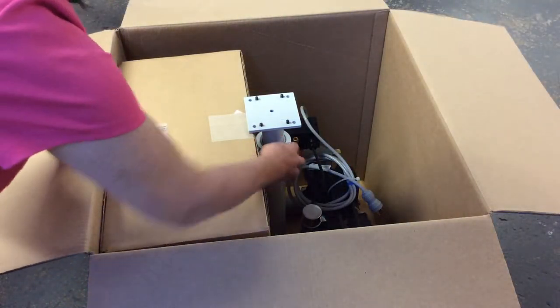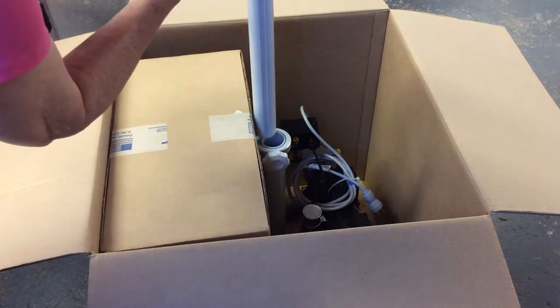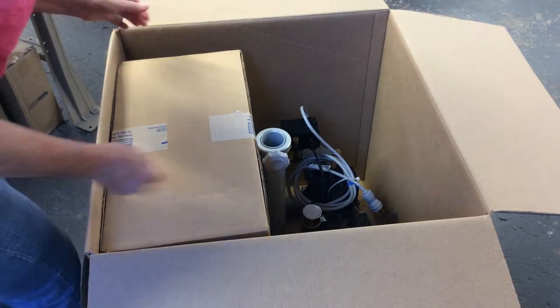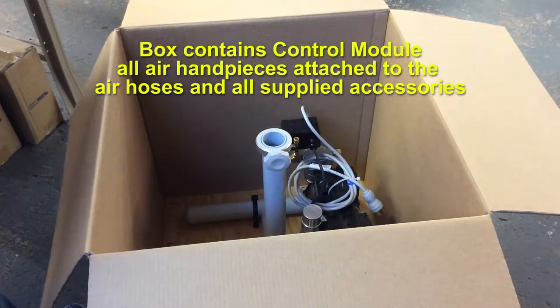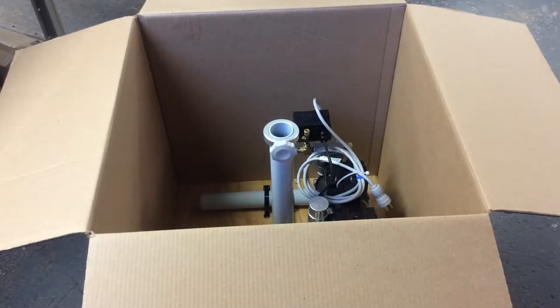First, unscrew the knob and pull out the platform. Next, pull out the box. Third, pull out the compressor with the H-frame.